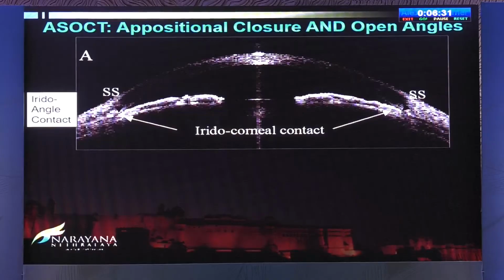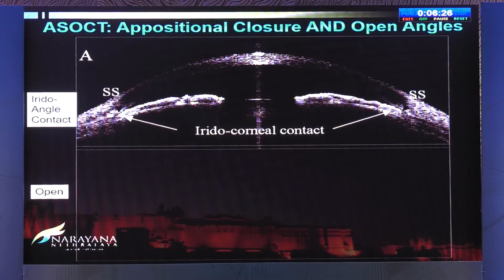Now, we know that in ASOCT, the irido angle contact is something that can be measured.